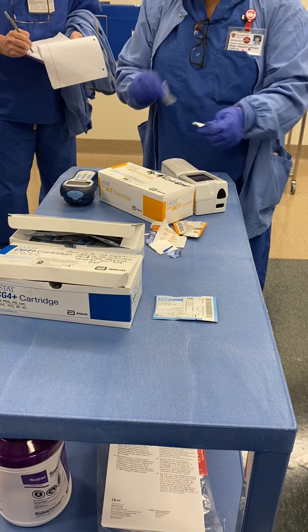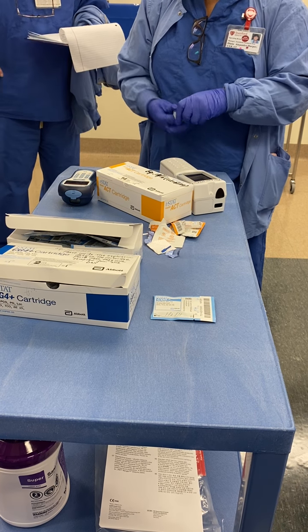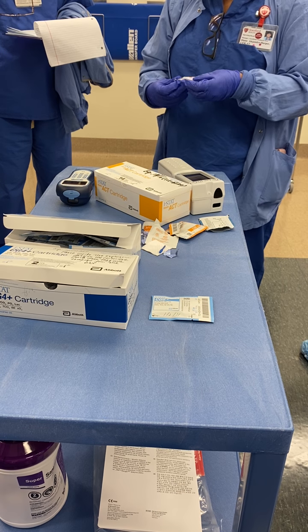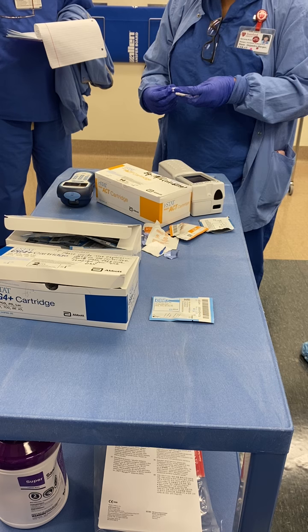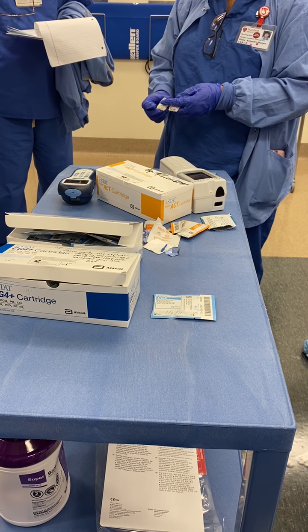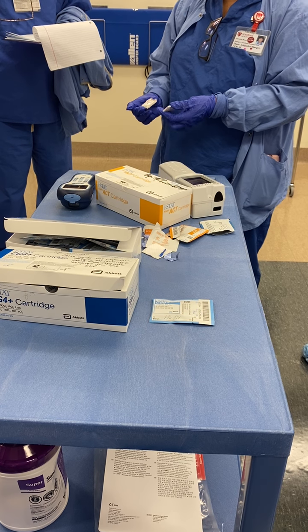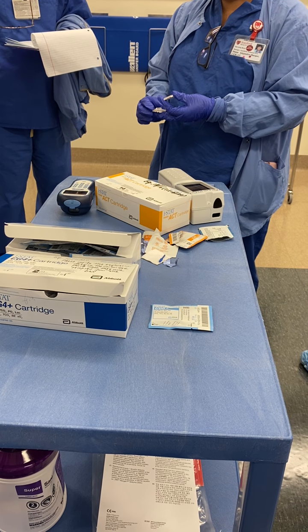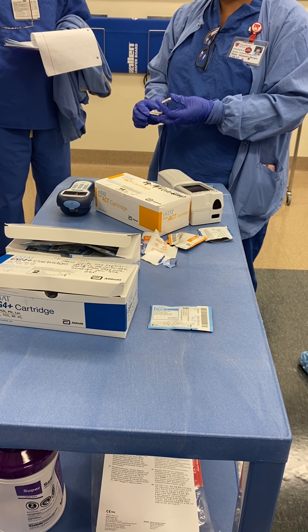I remove this, take this out. It looks the same concept. What we learned in that class is that we're not supposed to touch around the top of it. It should be on the side of it because it can ruin the reading. Yes.